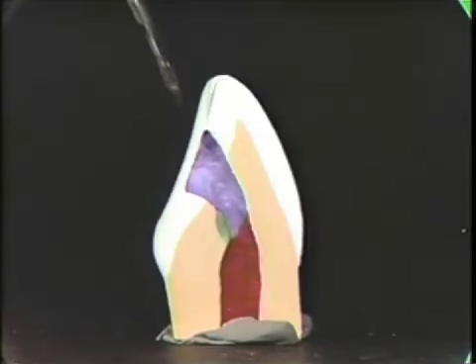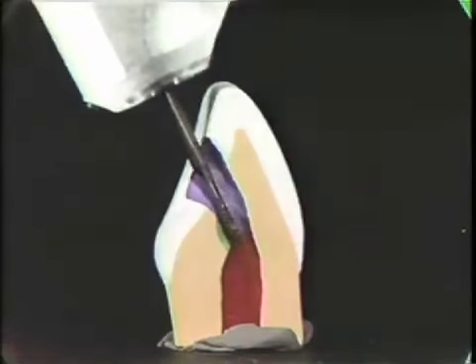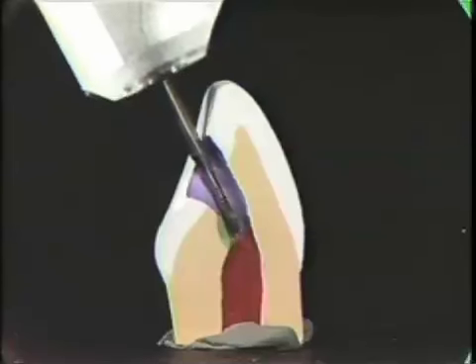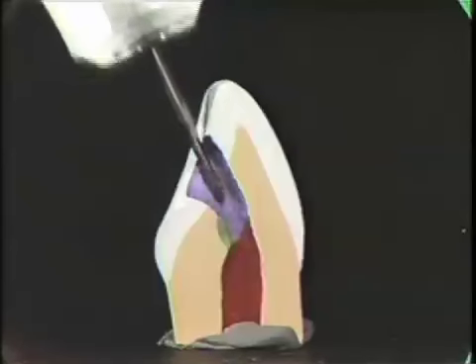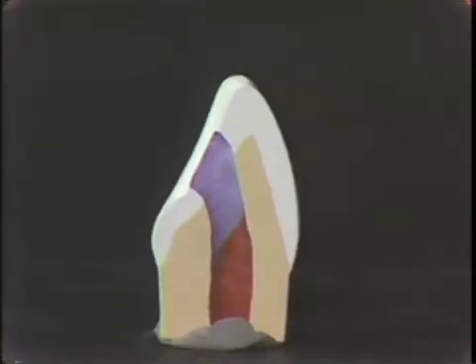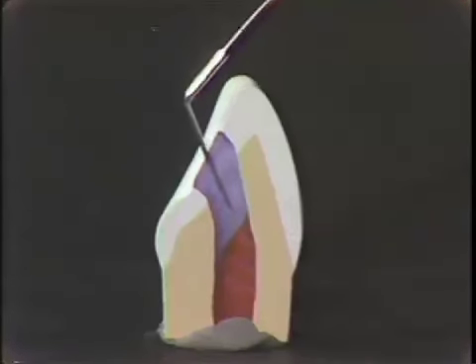Then with the surgical length flame-shaped burr, we enter into the pulp chamber and smooth the walls and flare the walls of our access preparation. This is a very inefficient cutting instrument, so you have lots of control to completely smooth and flare the walls. Once this is done, your preparation should be complete. All that's necessary is to check and make sure that the roof has been completely removed, that you have access, that you've not gouged the tooth, and that you fulfill all of the requirements for a properly designed access preparation.